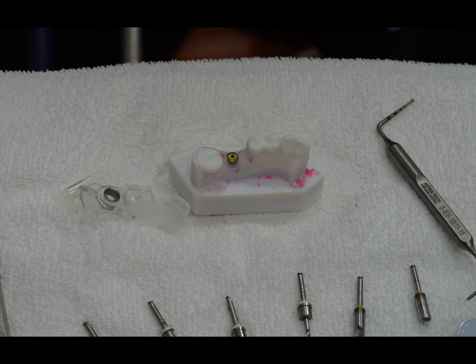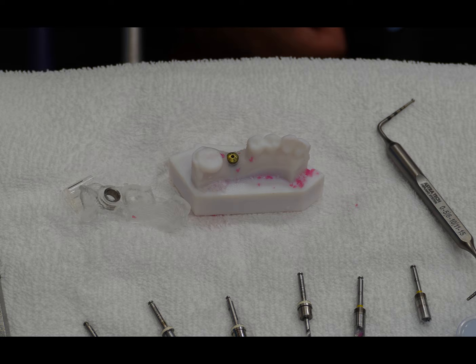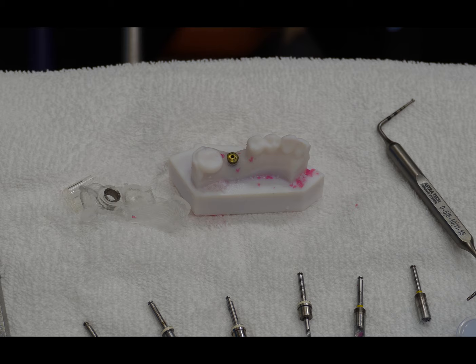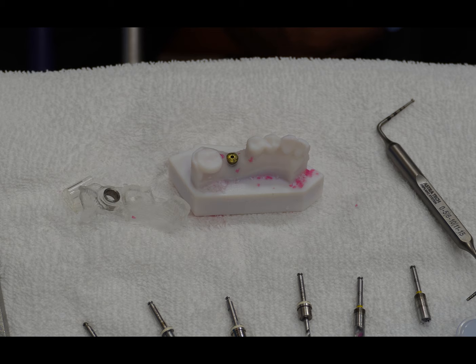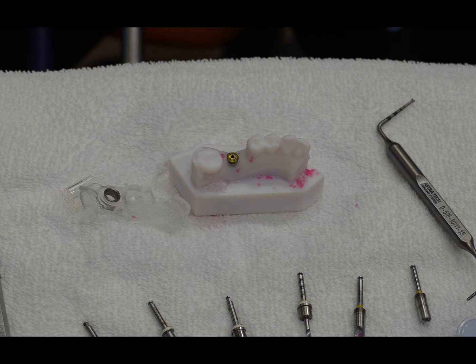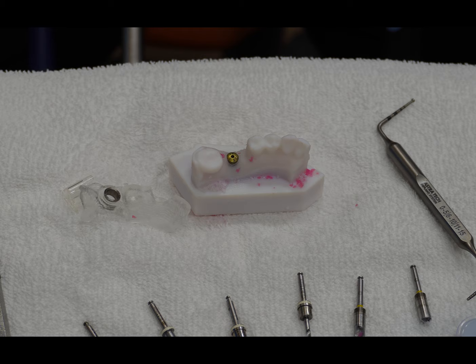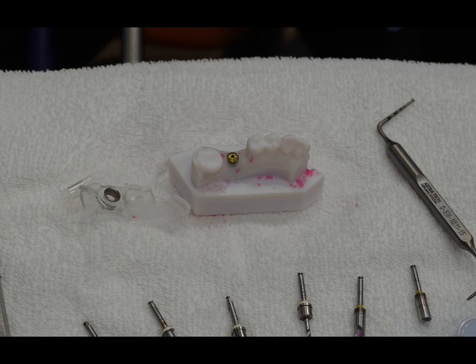Guided implants will be very simplistic to restore — parallel with the adjacent teeth for a screw-retained restoration — and that is the workflow that Digital Workflow Dentistry uses. As an additional option, if this was an immediate case you could use a temp abutment and build acrylic or composite around it to create a custom healing abutment. Or you can scan and start fabricating your custom abutment and crown. With the new Prime implant coming out, because of its coarser threads I would often place the scan body at the same time if using a tissue punch. If flapping or doing an immediate, I'd place the healing or custom healing abutment then scan at about 2 months.